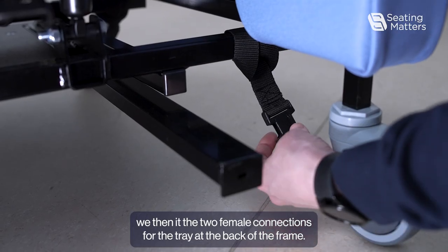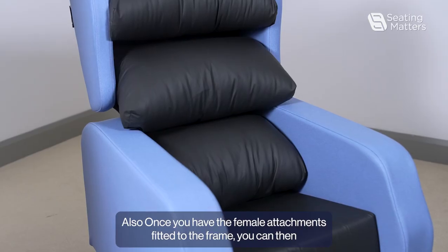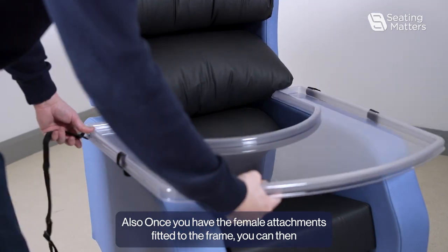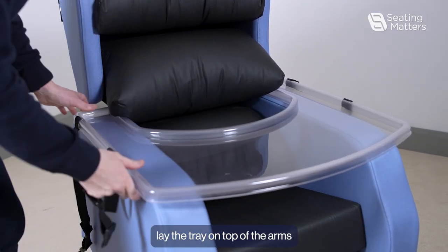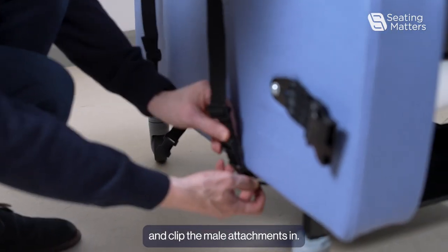We then need to fit the two female connections for the tray at the back of the frame also. Once you have the female attachments fitted to the frame, you can then lay the tray on top of the arms and clip the male attachments.